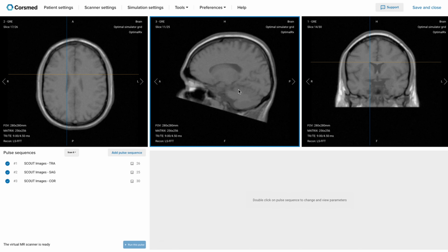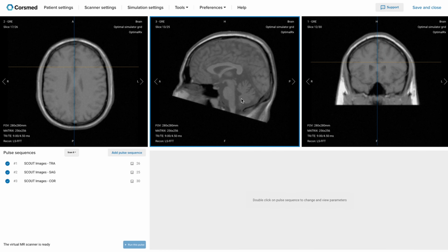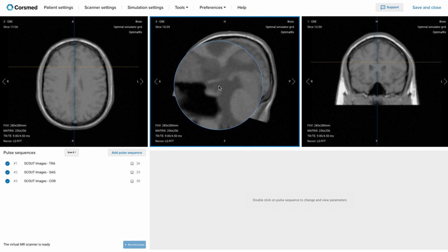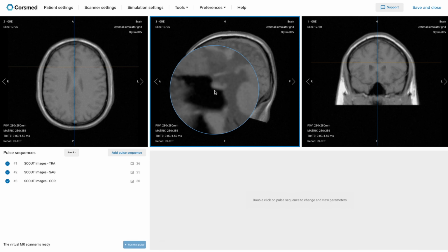As in a normal brain MRI, the localizers are acquired in the axial, sagittal, and coronal planes. But this time, we will use them to plan sequences precisely for the pituitary gland. This will create a zoom effect, where we will only visualize the portion of the anatomy that we need. Next, we locate central slices here, where we can visualize the pituitary gland and all its structures in detail. These structures include the optic chiasm and the sella turcica.